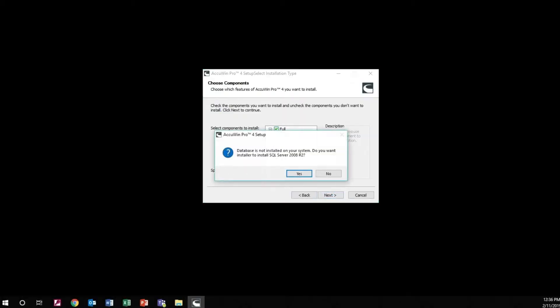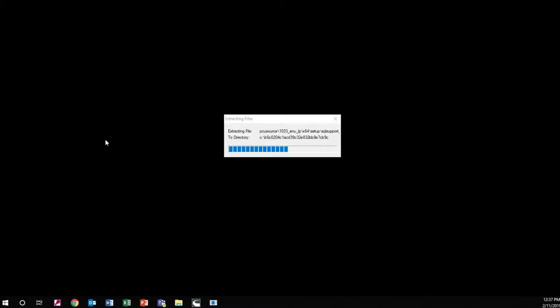If you do not have an SQL server installed, you will see this pop-up. Select Yes to install the SQL server.